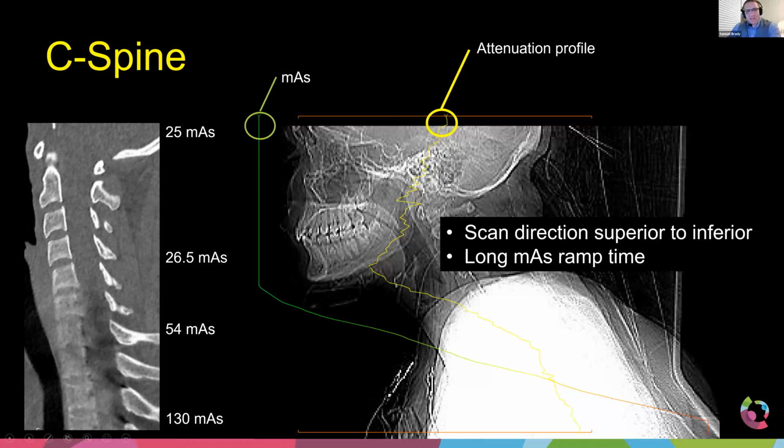And so you can see, when the system measures the attenuation properties of the body using this localizer, it calculates how much radiation output it would need to penetrate and create and reconstruct an image. Initially, as it's passing through the face, the overall head, and even through the neck, it's pretty much nothing. It's zero. Well, not zero, but it's hitting the minimum mA that we have allowed the system to go.